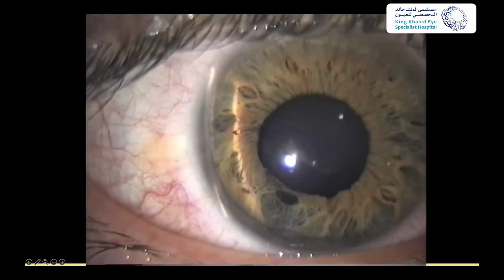And then when we do the Van Herrick in this eye, there's the ruler. And you could park a car in this anterior chamber. It's so deep, right? Super deep chamber. If I get this to stop, we'll see that this is another example of somebody with a normal deep anterior chamber.